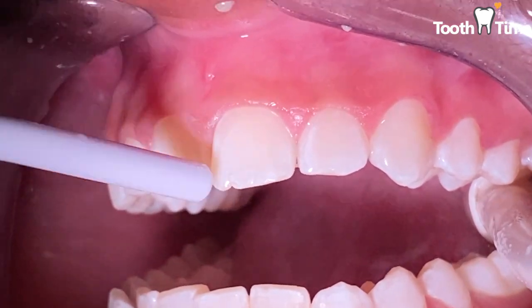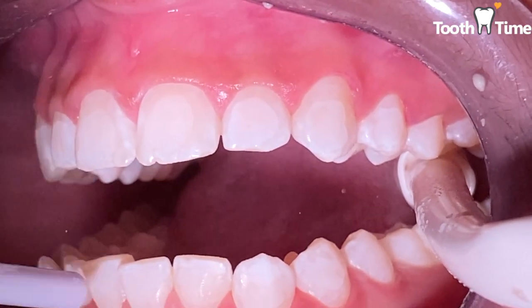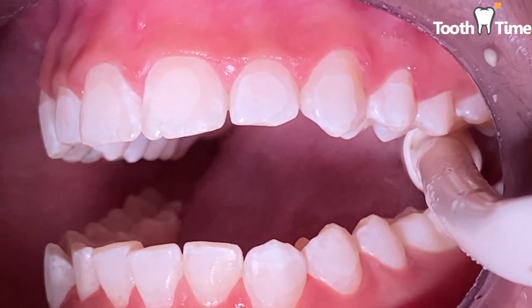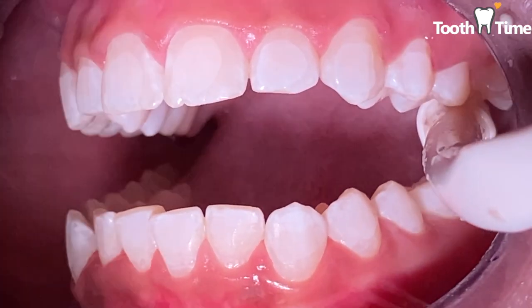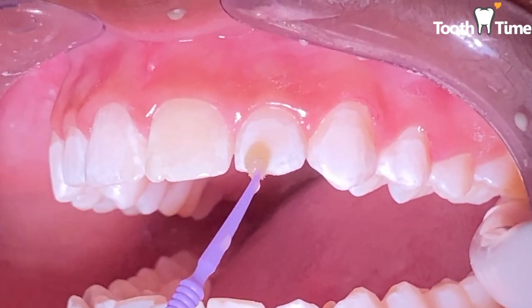Once we've washed everything out and dried all the tooth surfaces to make them really chalky, we'll apply the bonding material to the outside surfaces of the teeth, and then we'll put the glue on our brackets and place the brackets on the teeth.